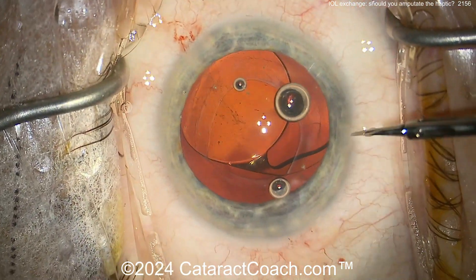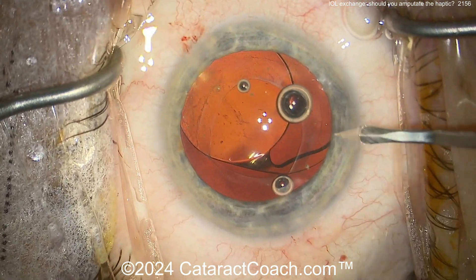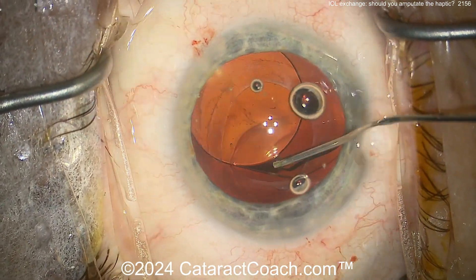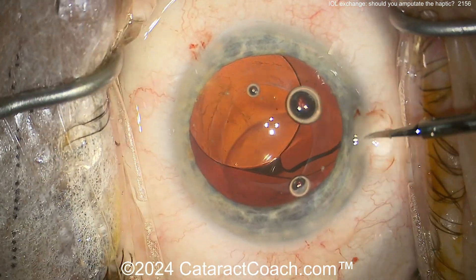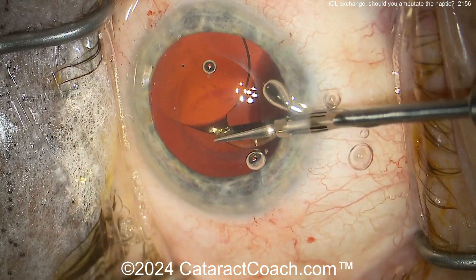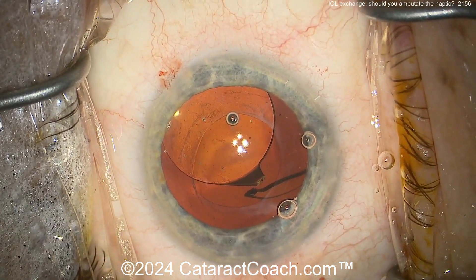So in this case the surgeon is going to make the decision of amputation — just cut it off. We can leave the haptic in the capsular bag. Look at all your routine cataract surgeries — they all have an optic plus two haptics in the capsular bag, so there's no harm in leaving it behind. You do want to make sure it's not going to be in the patient's visual axis.